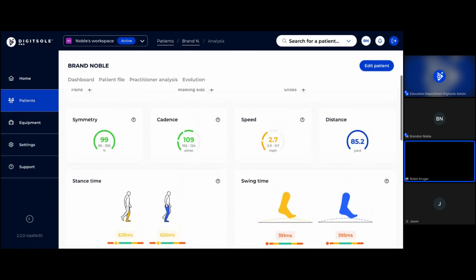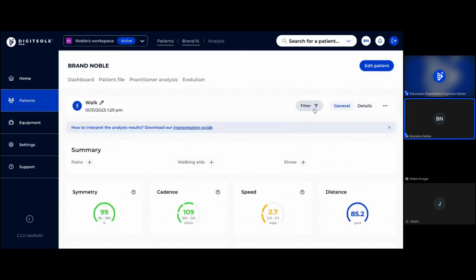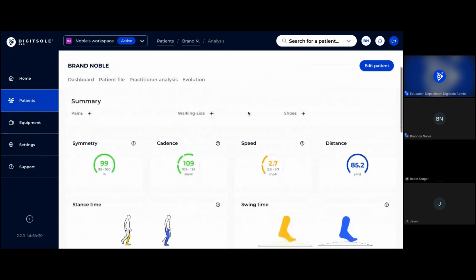Yes. So just so you know, in your system now, you'll need to do this on... So what you'll need to do is, I'm sorry, did you say Jason? Who's your representative? I'm Jeff. Sorry, Jeff. Who's your sales representative that you're using their tablet? Jeffrey Sheehan. Oh, Jeff. Yeah, okay. So what you'll just need to do is ask him to log into the web interface, and he'll help you with the username and password, and you have to create the filter on the web interface. Okay. Just so you know. And all you do is create a custom filter, name it, and then you can select the data like we showed you. Okay.